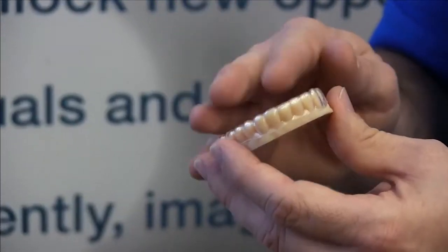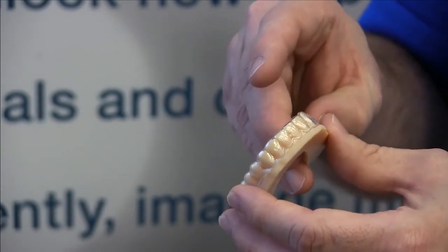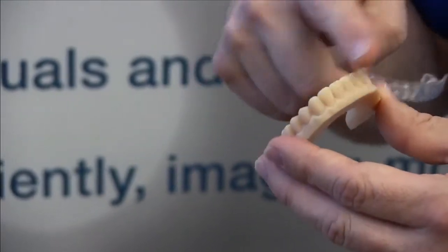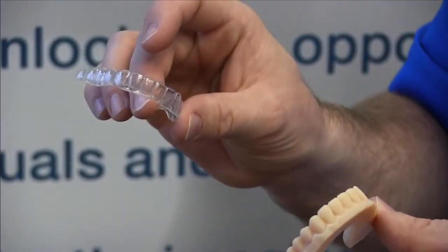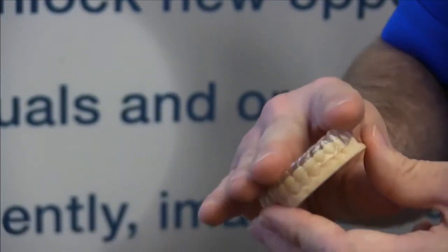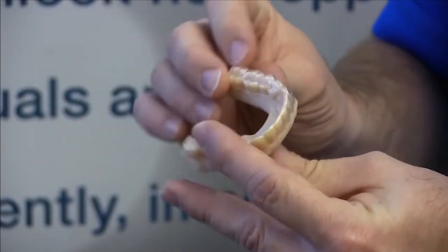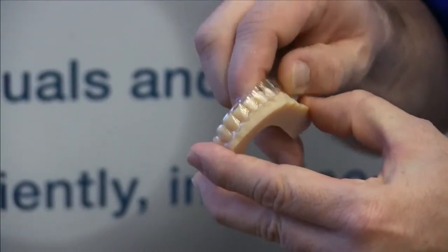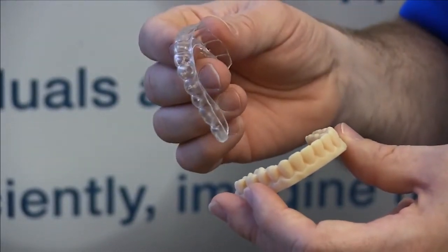This is a model that we typically print for a visible retainer or an invisible liner. When we print the model, we only need the teeth and a little bit of gum work. We take a piece of material for orthodontics and thermoform that material onto the model. Once it's thermoformed on, we trim the edges so that the patient can comfortably put it in their mouth. As you can see, it has a fair amount of retention, so once they snap it in, it stays in there very well.